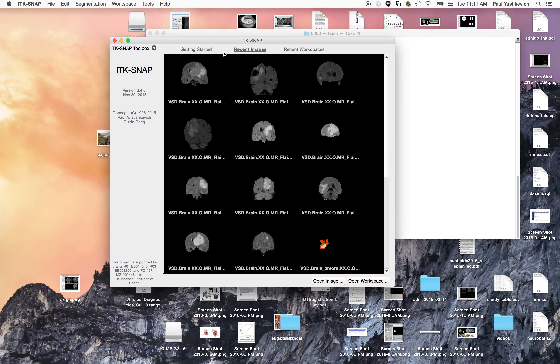Hi, so this video is meant to show the steps for the protocol for doing tumor segmentation from the BRATS dataset for the ITK SNAP validation paper. Before I start, a couple things just to remind you of: make sure that you're using the right version, it should be 3.4.0.0 and not any other version. Also make sure that you time your segmentation — from the moment you open ITK SNAP until the moment you close it — and then record that time in a spreadsheet.